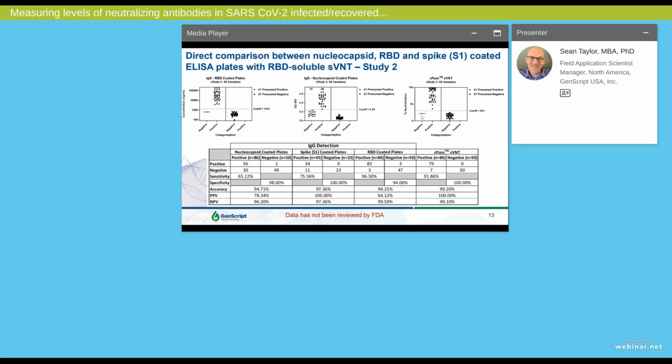Corroborating that, the 1 false negative sample was, again, in common with all these tests. So again, we're pretty sure that this negative sample either didn't seroconvert, or more likely, it was called falsely positive by qPCR. But taking all that data into account from these 2 studies, and just using the qPCR data, so we just judged everything by the qPCR presumed positive data.